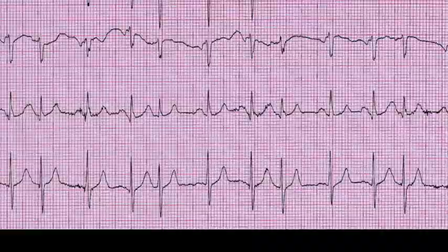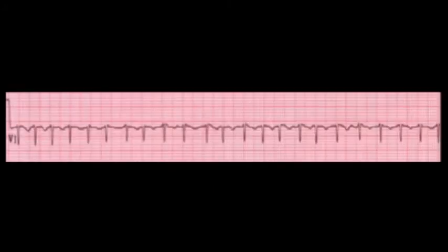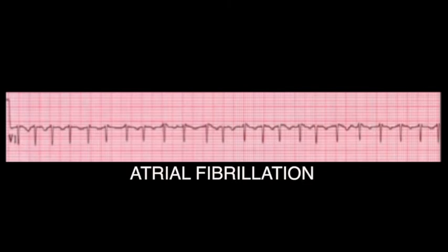If the initial inspection of the ECG determines that the rhythm is irregular, but there are no clearly discernible P waves present, look to see if there are F waves visible in any of the frontal leads or V1. The presence of F waves suggests that the underlying rhythm is atrial flutter. If there are no F waves clearly seen, then the rhythm is likely to be atrial fibrillation.